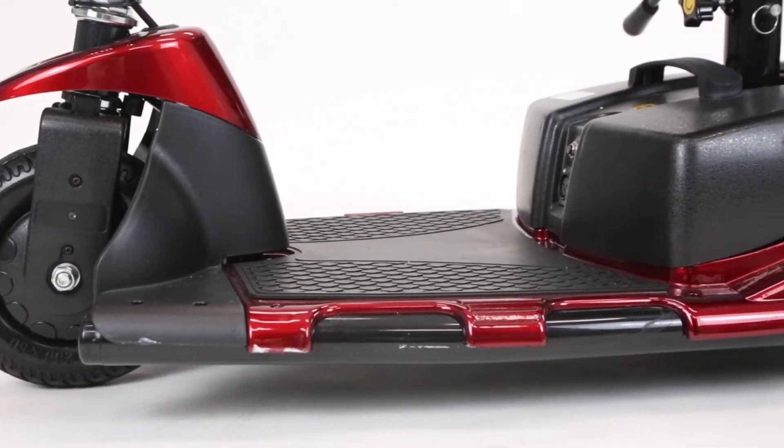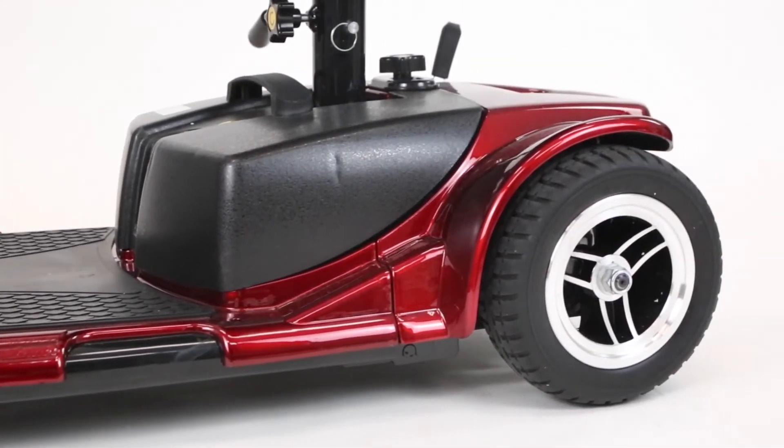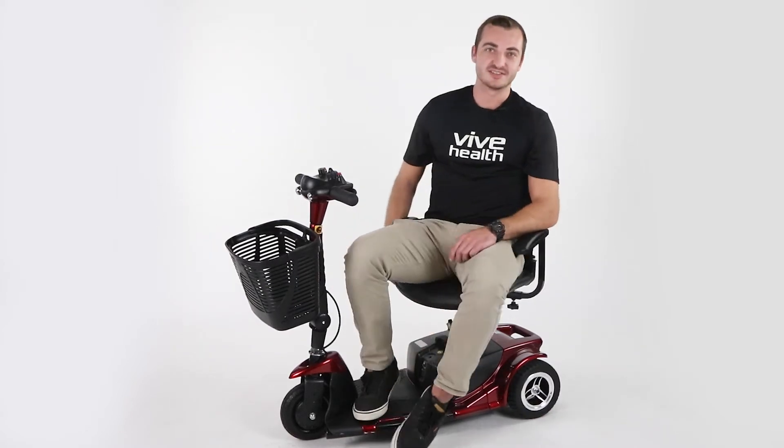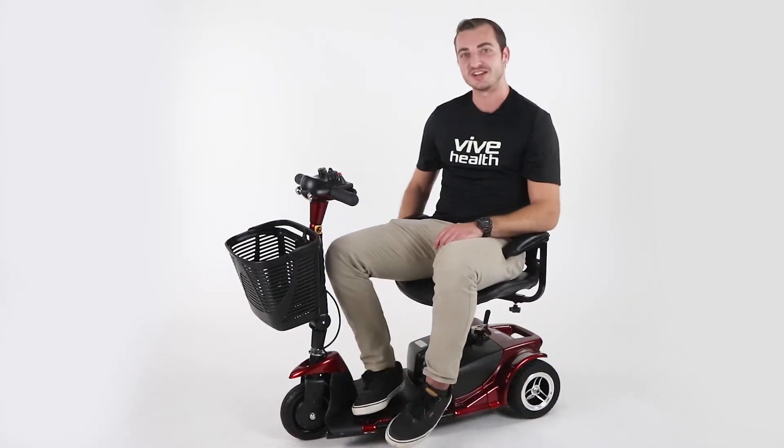The flat-free, non-marking tires make this scooter ideal for indoor or outdoor navigation. Another cool feature is the detachable swivel seat, which provides you with versatile seating options on the go.